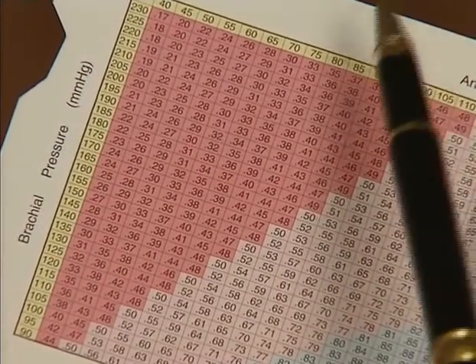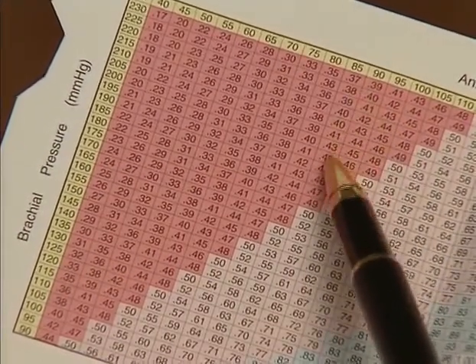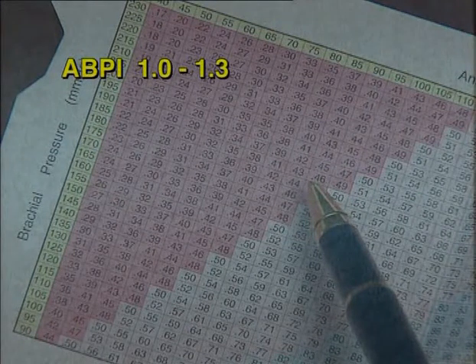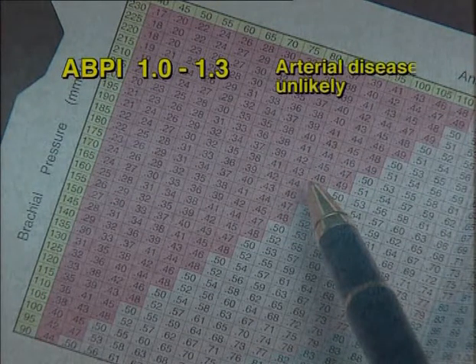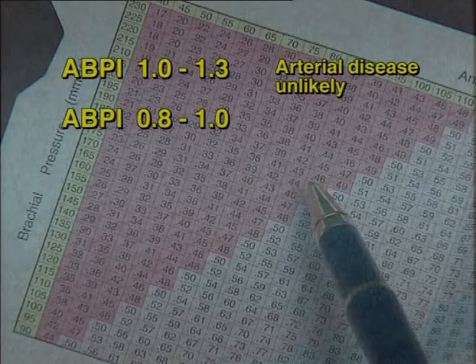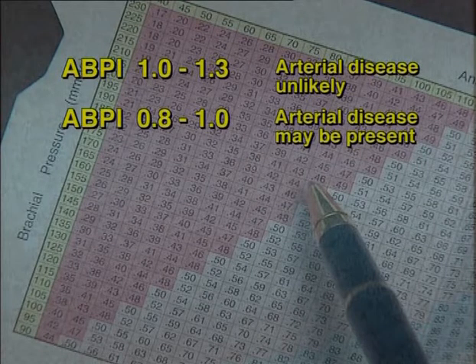Alternatively, an ABPI chart such as this could also be used. If the ABPI is between 1 and 1.3, the presence of arterial disease is unlikely. If the reading is between 0.8 and 1, some arterial disease may be present.